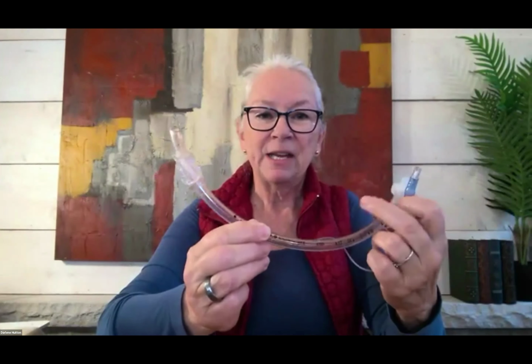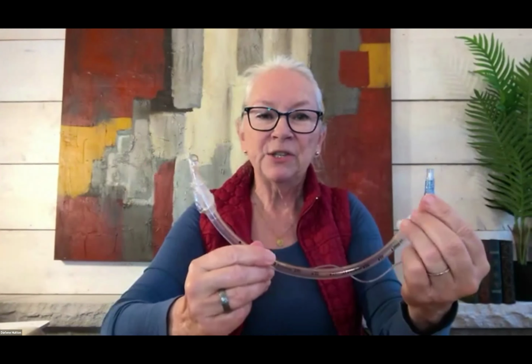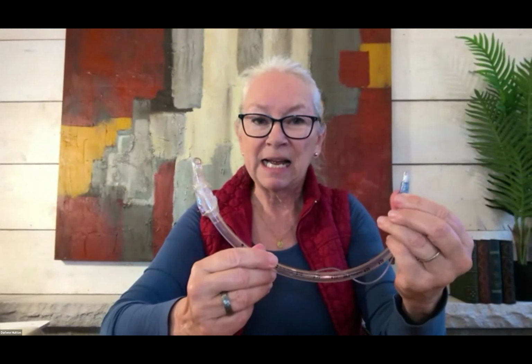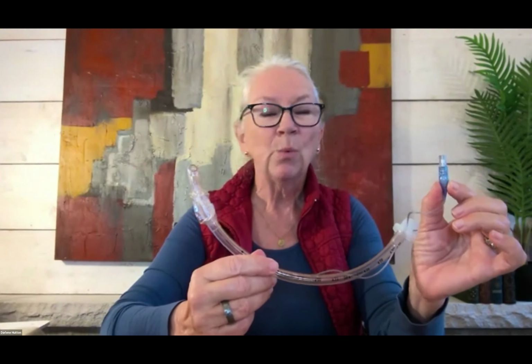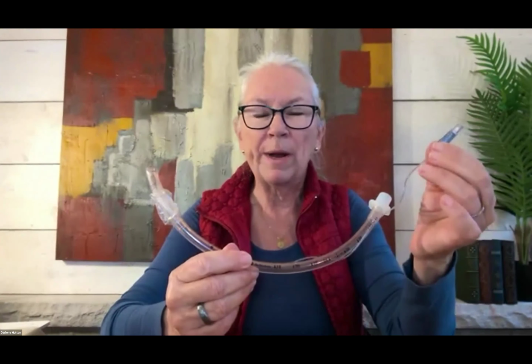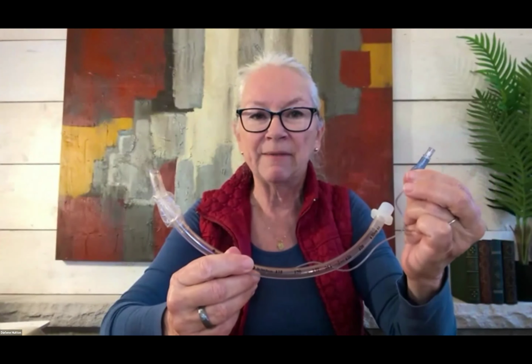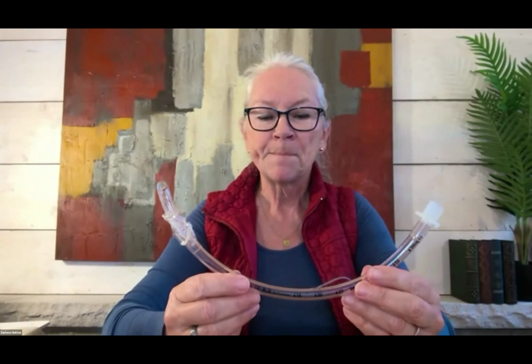You will notice that there is a cuff that you will need to inflate to insert this. And the secret of inserting anything that involves a cuff is you want this to be soft like a grape. We don't need to insert 10 cc's of air. It's whatever it takes to ensure we have a good seal. So that soft grape is what we're looking for.